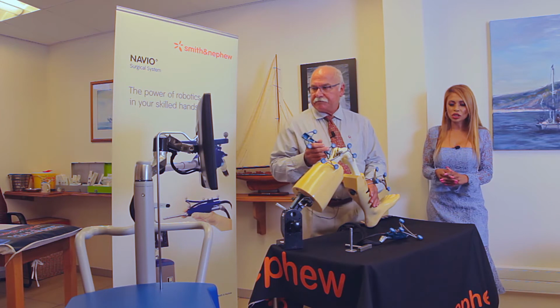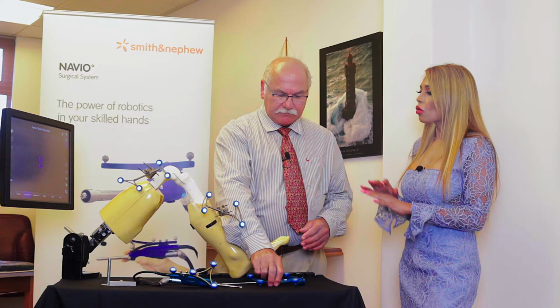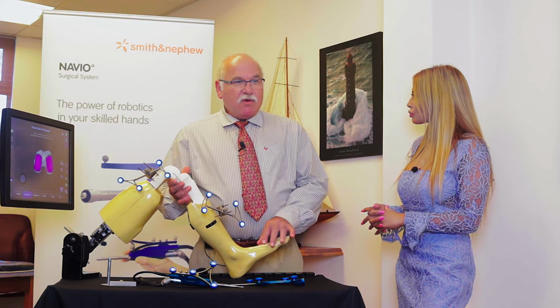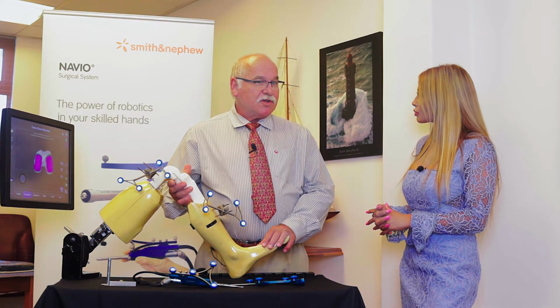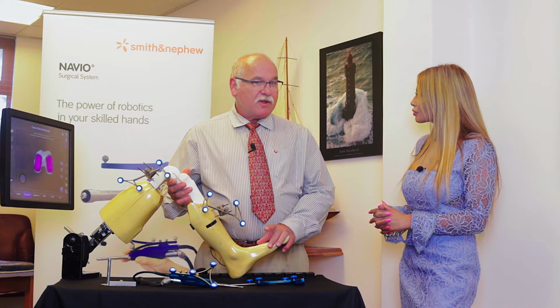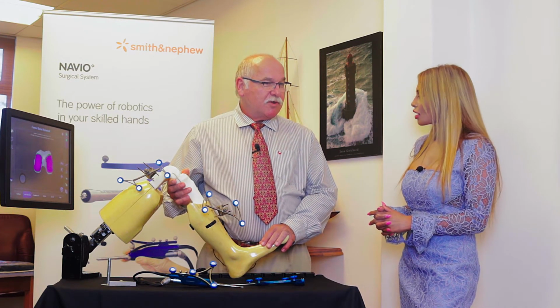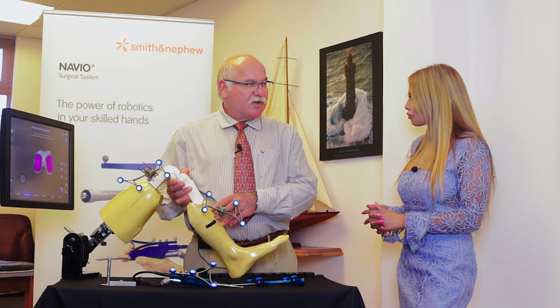So whilst you're doing your checks, is robotic assisted surgery used in all knee replacements, or only selected patients? It would be all knee replacements, but it is used in selected patients because, number one, there are medical aids that prohibit it, because it does add a little bit more time. Secondly, there are contraindications. For instance, if the patient has bad skin, you don't want to put pins into a bad skin area, or if the patient is excessively overweight, going through a lot of fatty or adipose tissue is contraindicated. But for the rest of the patients, we use it for all our patients.